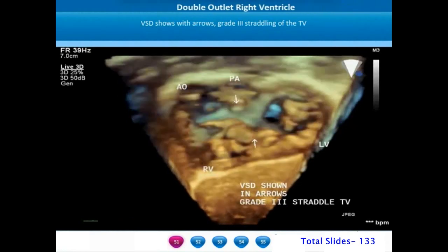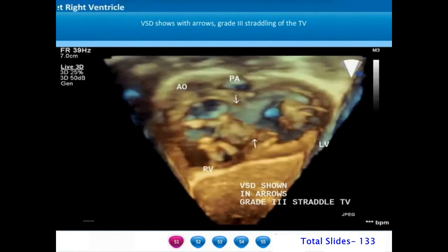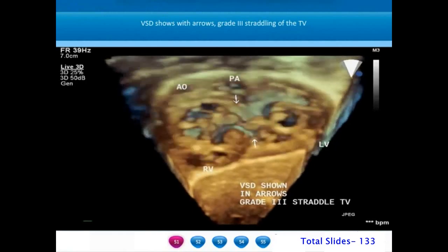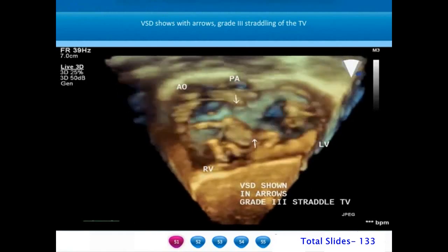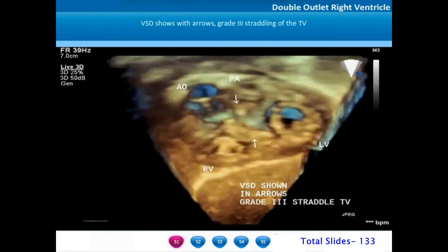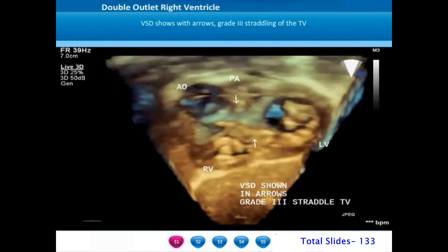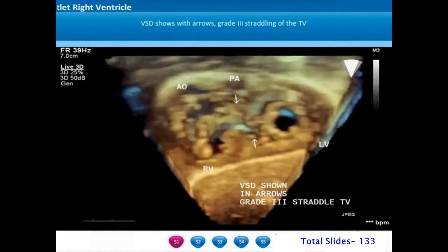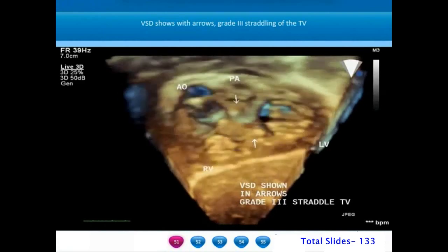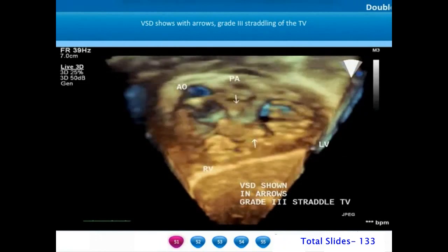This is a three-dimensional view of the left and the right ventricle. We have cropped off the entire apical and mid portion of the right and the left ventricle to show the basal portions of the left and right ventricle. We can notice the mitral valve and the tricuspid valve apparatus. The tricuspid valve chordae are seen to cross over the ventricular septal defect towards the posterior and inferior wall of the left ventricle. The two arrow marks show the anterior and posterior margins of the ventricular septal defect.